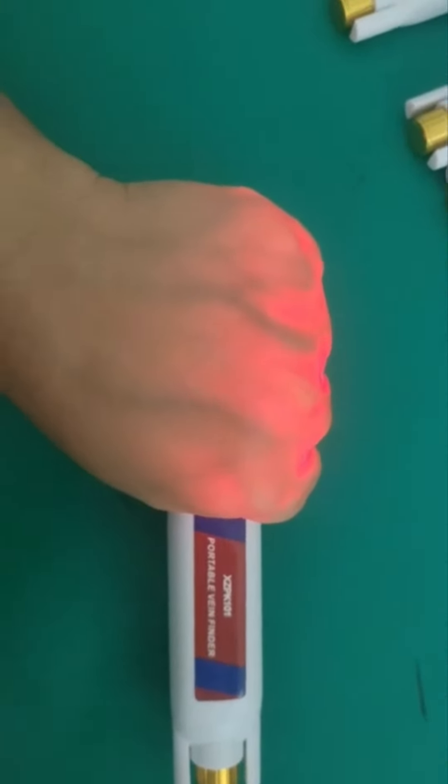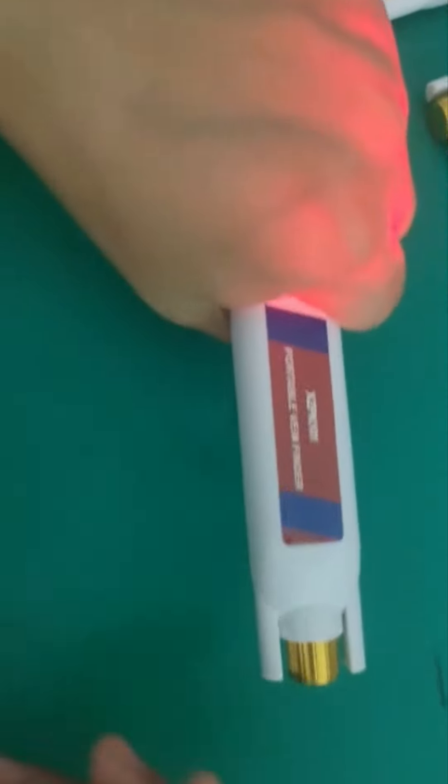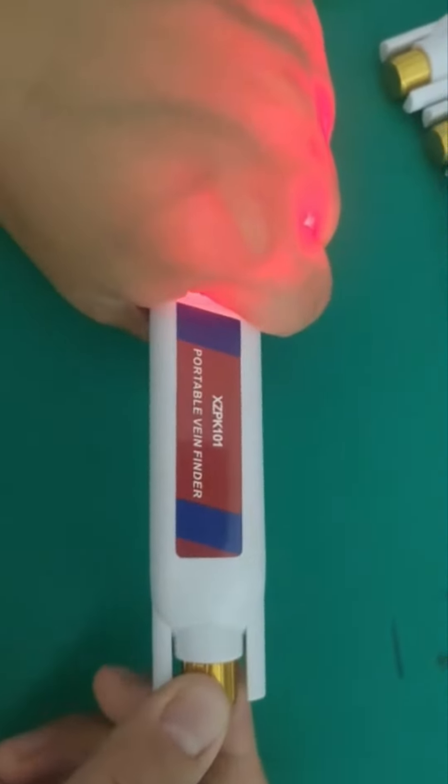If the patient has fairer skin or the skin is much darker, you can adjust the knob bigger. If the vein can be seen very clearly, more clearly.